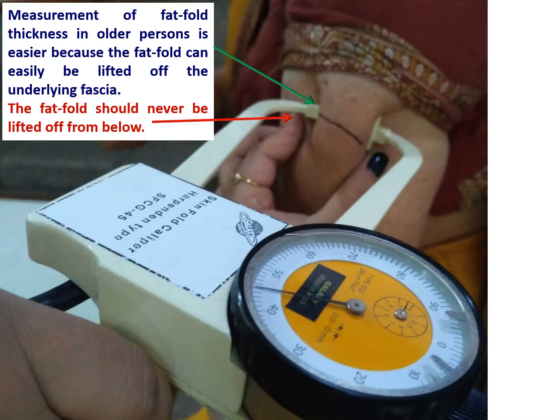The fat fold should never be lifted from below the mid upper arm circumference marking. This is a temptation for people who are shorter than those on whom they are measuring the fat fold thickness, but will inevitably result in the fat fold being underestimated as compared to measurement taken by the Harpenden when the fat fold was picked up just above the mid upper arm mark.